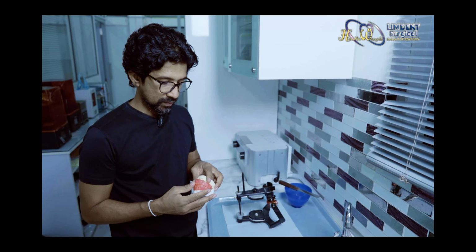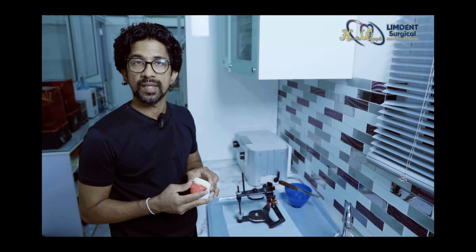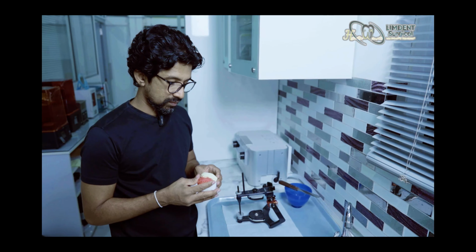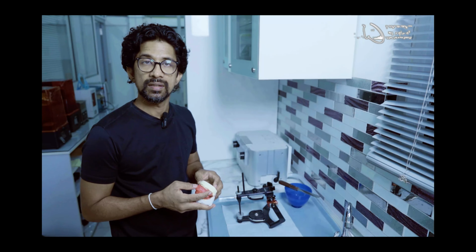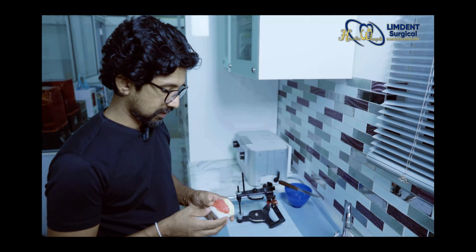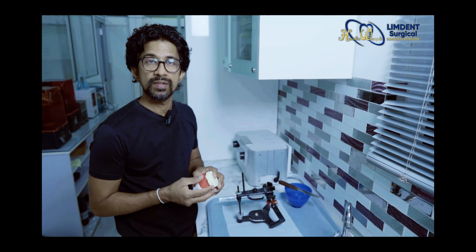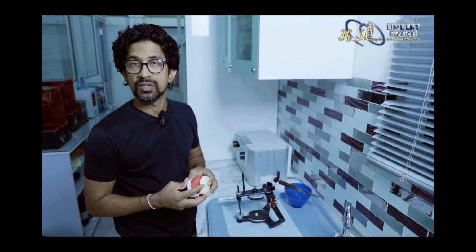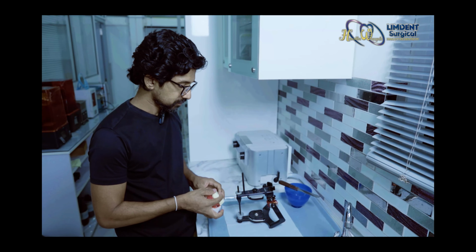So I always mount the cast, even though digital dentistry is helping us to get the maximum out of it, but we always have to go through this manual handling of these cases with the bite registration. I can explain to you after the steps that we're going to do why we have to have this manual handling of these cases between the digital involvement of the case management.